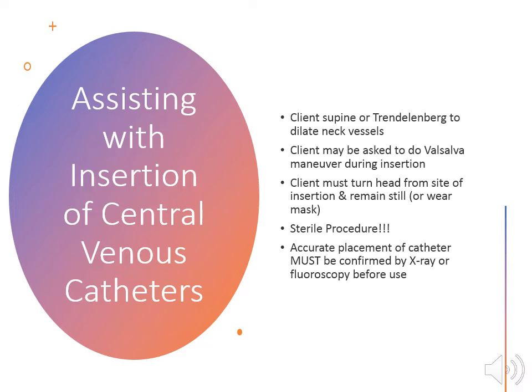When assisting with insertion of central venous catheters, there's a couple key things to remember. The client should be supine or Trendelenburg to dilate the neck vessels. The client may be asked to do the Valsalva maneuver during insertion. So just think, what are some of the reasons why they may be asked to do this Valsalva maneuver? What it does is it produces a positive phase in the central venous pressure, which decreases the chance of air entering circulation.